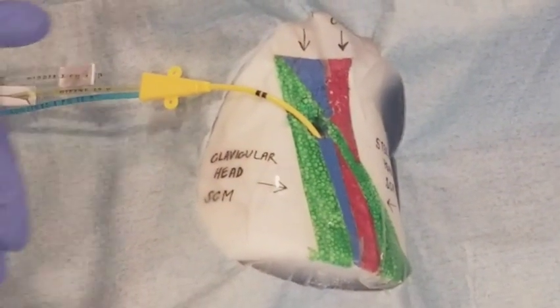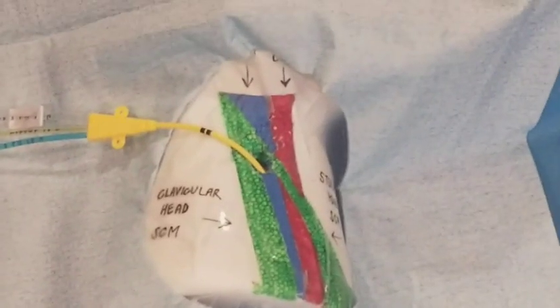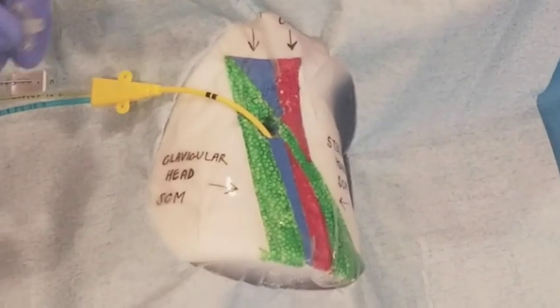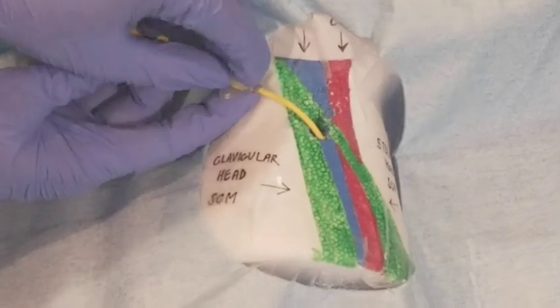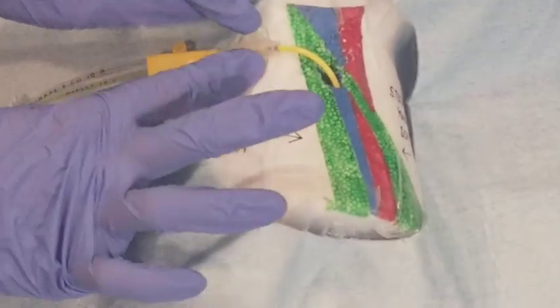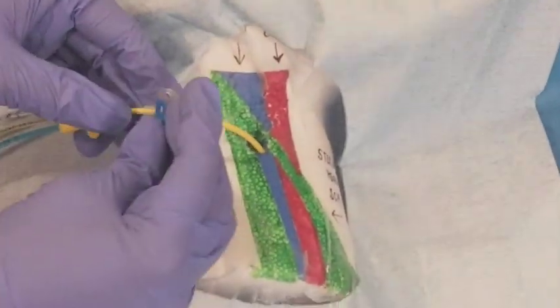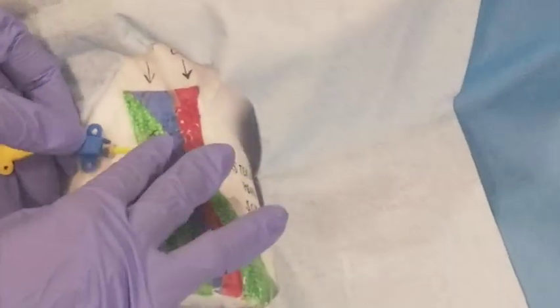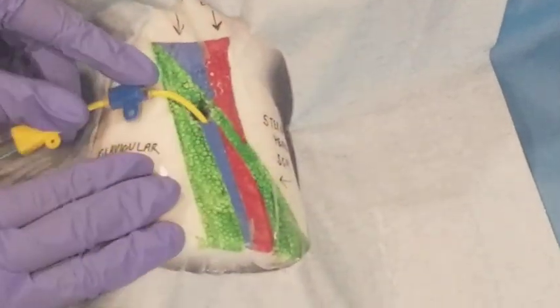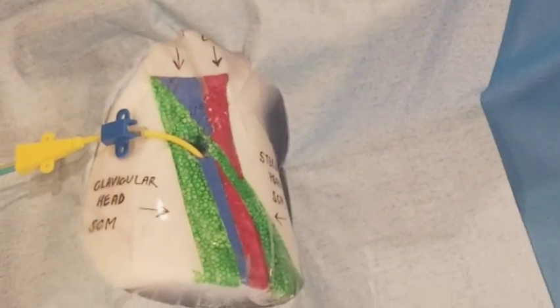We have a white fastener and a blue fastener that goes on top. This will secure the line in place. So what I want to do is go ahead and attach it at that point. Secure the blue over the white. And we're going to go ahead and secure the line with a suture.